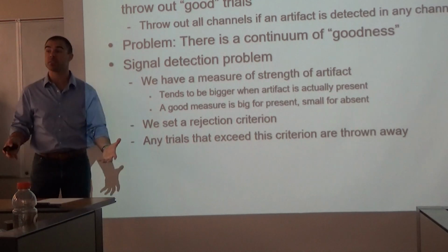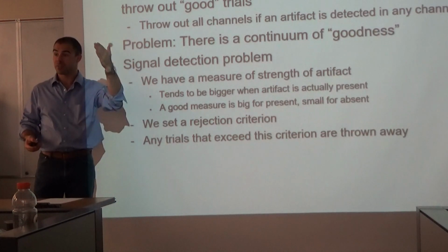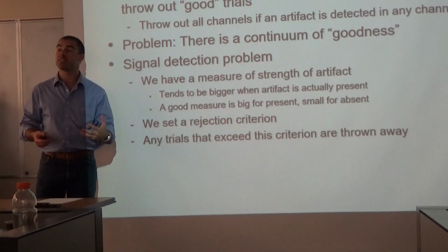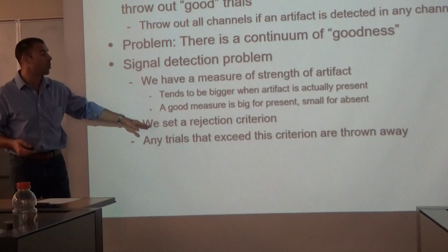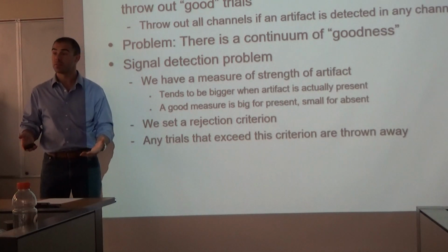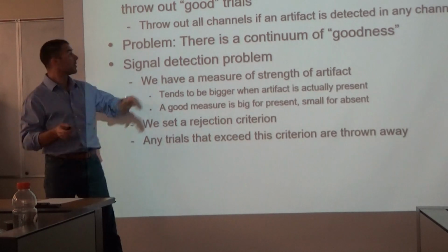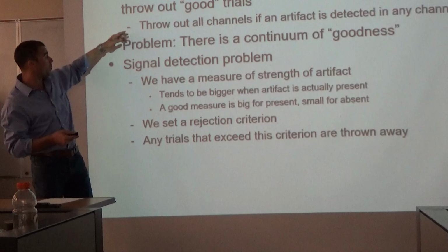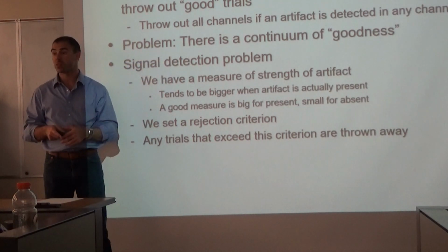Now remember we talked about signal detection theory last class. Remember we talked about setting that criterion? Right? We're looking at that framework now in the context of physiology. So we have a criterion for what amounts to being good and what amounts to being bad. And we already talked about how that can shift in certain situations, right? Even up here, right? Wherever that was. So there's a continuum of goodness. So we'll talk about that too.